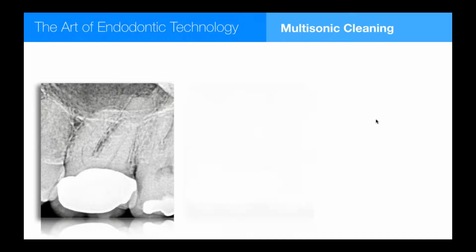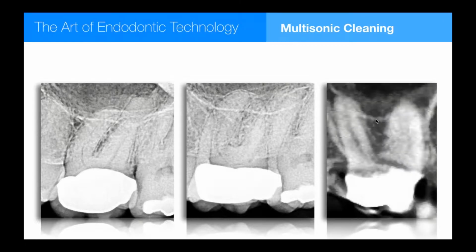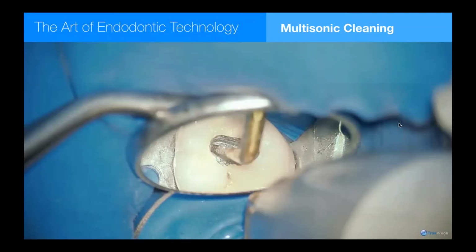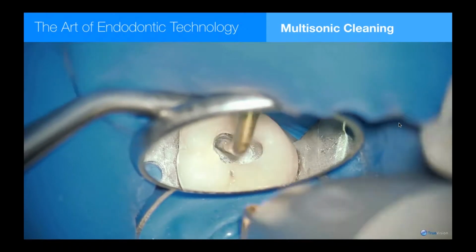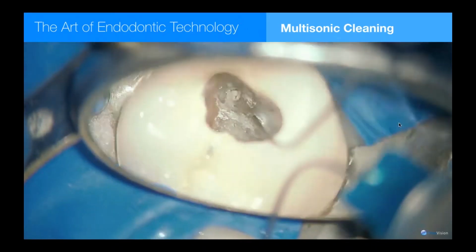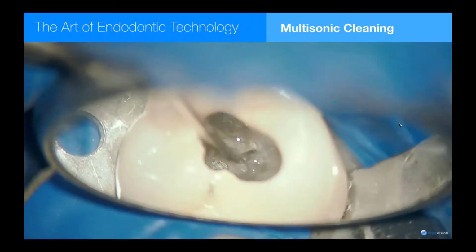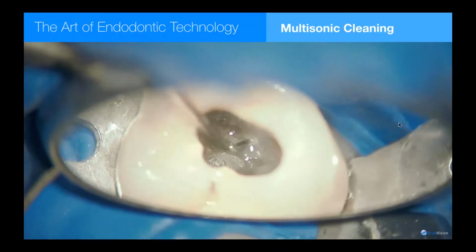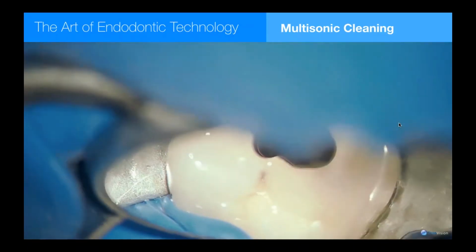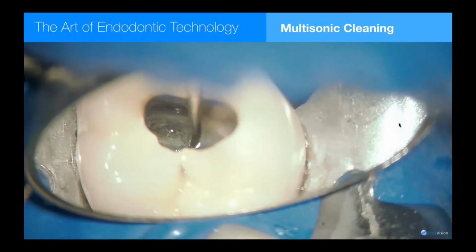Upper molar, MB root, quite a bit of curvature. I look at the CT imaging. Unfortunately, there is a fourth canal there, but it's super faint. I can almost see nothing until I get to the middle of the root. So let's look at some video. I looked forever for this. The only time I've not enjoyed having a CT machine is when it tells me for sure there's an MB2 and I can't find it. So I'm using EDTA solution to help remove the smeared layer. That makes it much easier to see the dentin coloration as a map to look for MB2 canals.